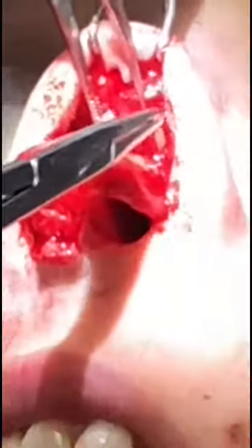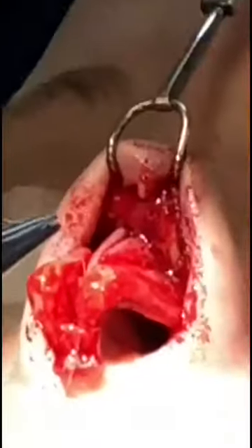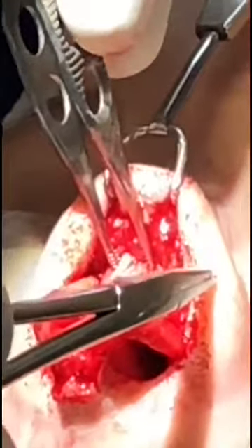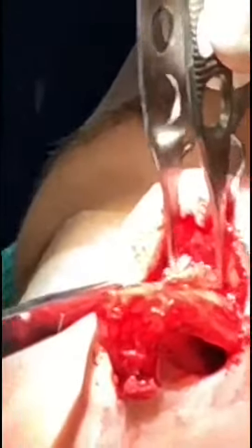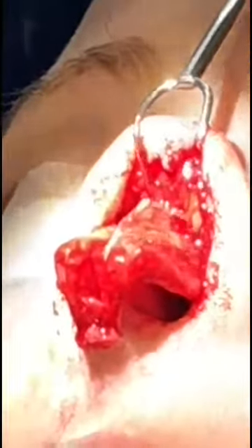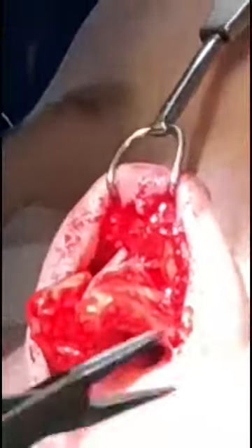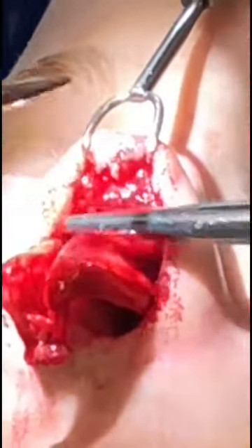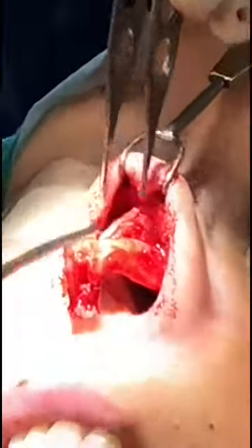So to help bring the nose over to the left, we're putting a spreader graft in on the left side. Sometimes you can't get the cartilage to be perfectly straight — the cartilage is very elastic — so we just have to make it appear that it's straight. We can do that by sewing the spreader graft in, a little piece of cartilage right there between the septum and the upper lateral cartilage. You can see the middle third of the nose is starting to look straighter. It's getting a lot straighter, so we're improving there.